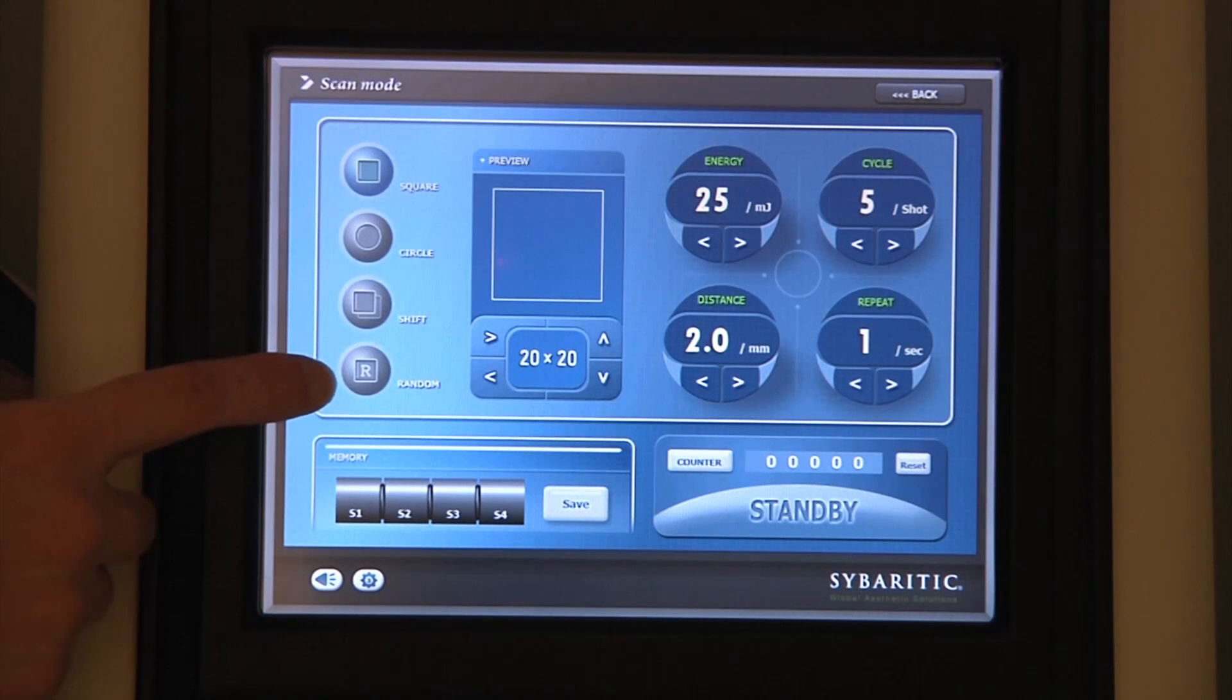In the random button, this enables us not to create a linear deposition of energy through the spots, but actually to deliver them randomly throughout the scan area. The benefit of this is if we are using a very high dot density and we want to minimize local heating effects.